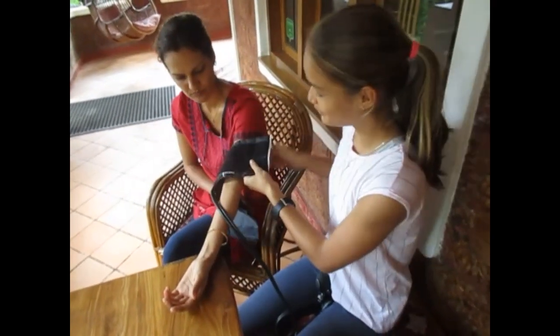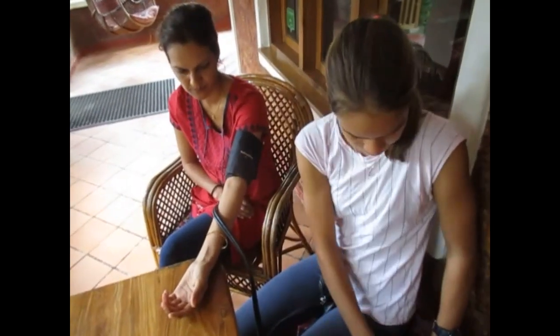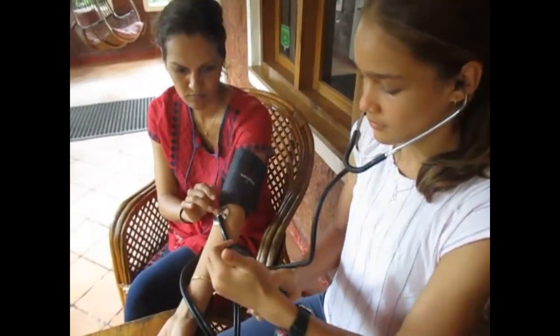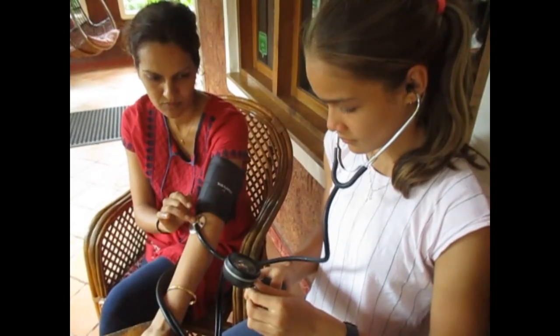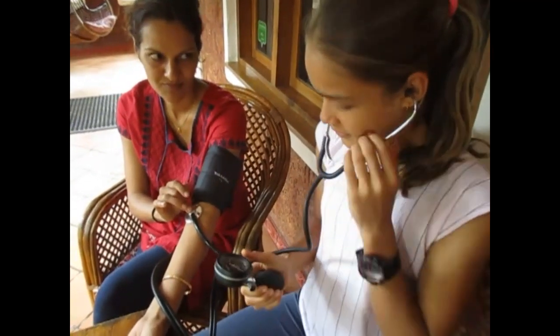Now I'm going to measure my mom's blood pressure, and I know she has low blood pressure. So she does have low blood pressure. We still didn't get a person with normal blood pressure — only high and really low. After my mom measured mine, I have about 110 over 80, so it's also a bit low, but not super low.